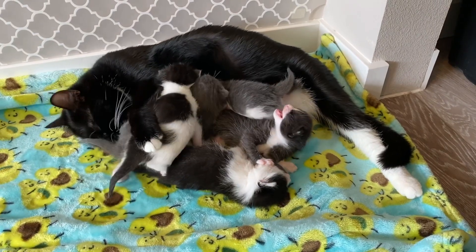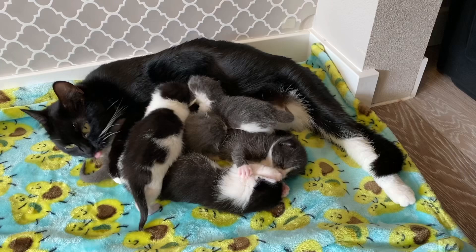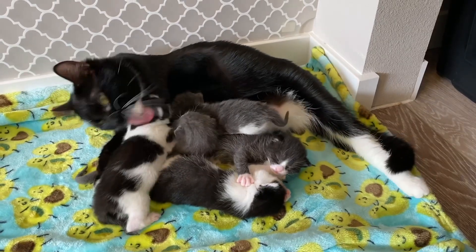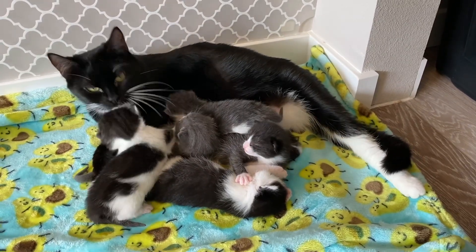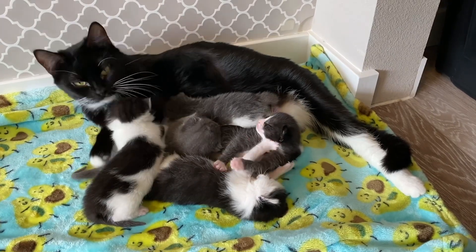Hi everyone, today I'm going to show you how I tube feed one of my foster kittens, Mouse. Long story short, he went four days without gaining any weight and it was clear he needed some assistance getting the nutrients his body needs.